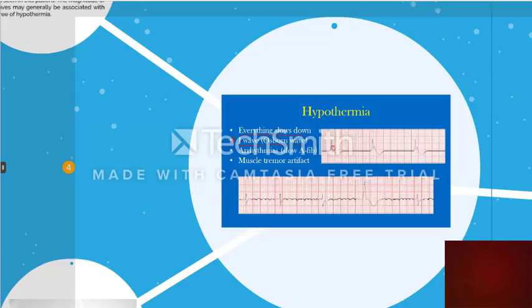What we're saying is that something you'll see in hypothermia, and it's pretty much diagnostic, is ST segment elevation. We have the abrupt ascent at the J point. So this point right there is our J point, right? It goes up and then drops back down to baseline. We call that a J wave, so at the J point we can get a J wave. It's also known as an Osborn wave, and if you see that, it is almost diagnostic for hypothermia.